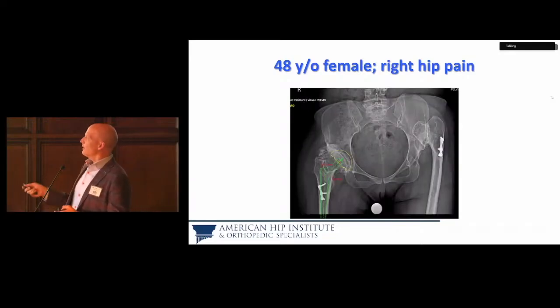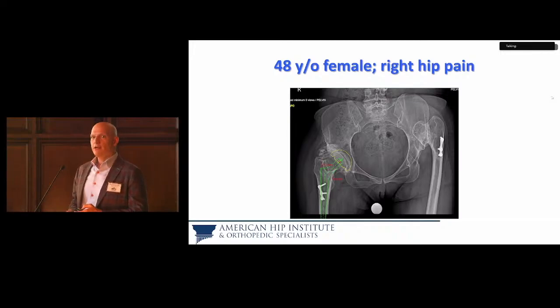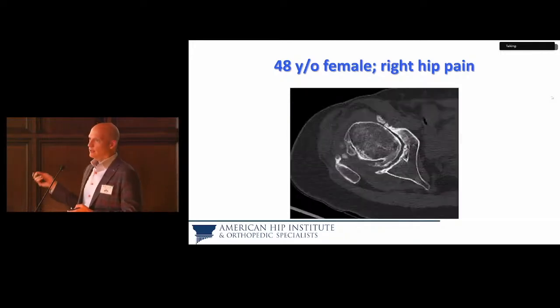All right, well, I'll just take the plate out. I'll put in a little Wagner cone. Cup, I can probably get in a fairly standard cup. This shouldn't be that bad. Well, CT, yeah, that's fairly standard. I can get a cup in there. That shouldn't be too big of an issue.